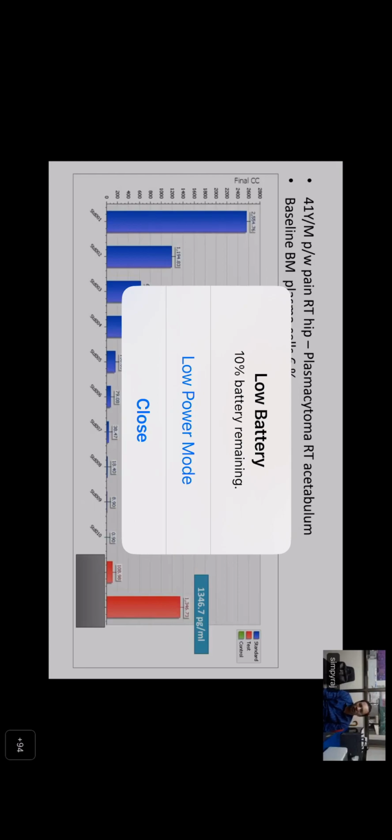So what investigation do you want to do in this patient? We have done VEGF levels. VEGF level can be done by ELISA, and it can also be done by flow cytometry. We do it by flow cytometry here, and it was increased. You can see 1346 in plasma. So this was a case of plasmacytoma with POEMS syndrome because of all these features.